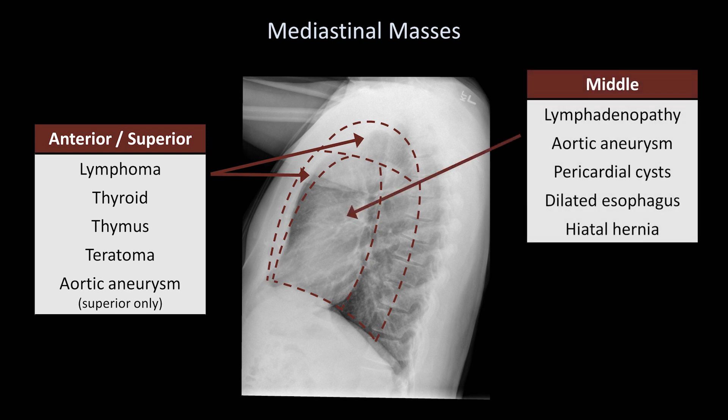The middle mediastinum includes everything within the pericardium, and is variably defined to also include the subcarinal, paratracheal, and hilar lymph nodes, and the esophagus. The differential diagnosis of masses here includes lymphadenopathy from any cause, an aortic aneurysm, pericardial cyst, dilated esophagus, or a hiatal hernia.